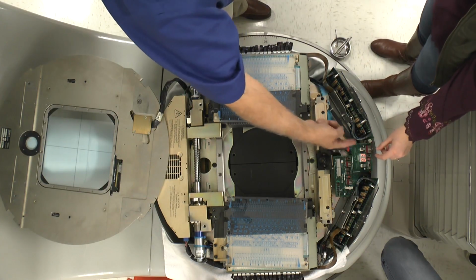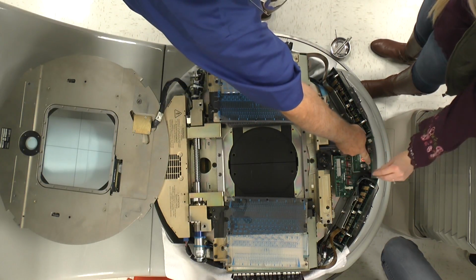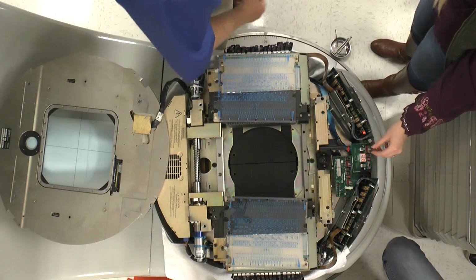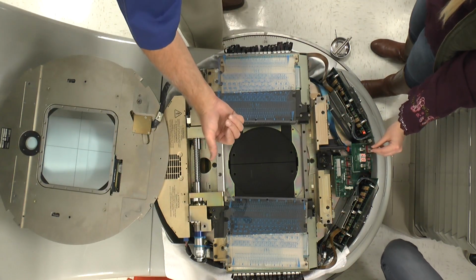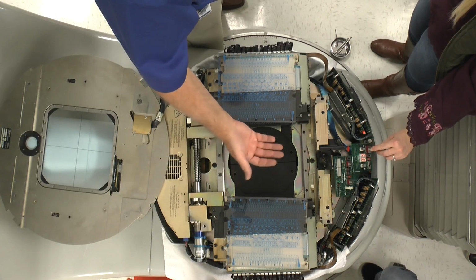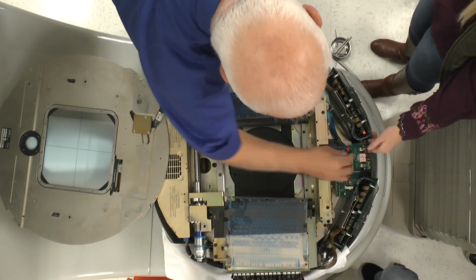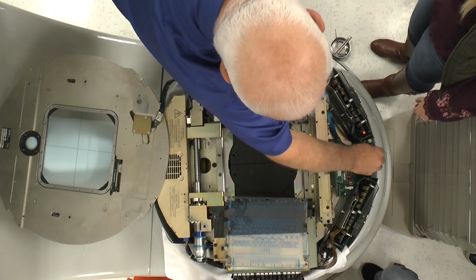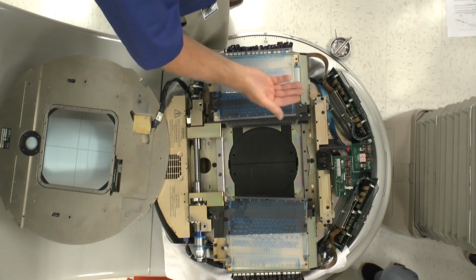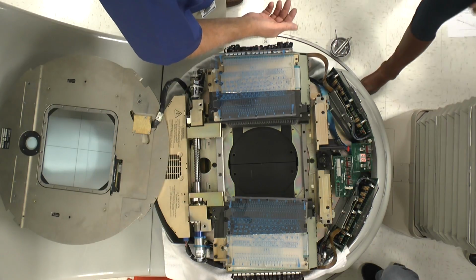So go ahead and switch it over to this side, the B side. This one. Over again, okay, and go up, and then back. That's good. We're just testing to make sure it moves. When it initializes, it'll put it all back into position. Go ahead and test 2.